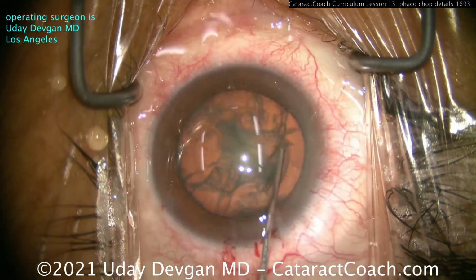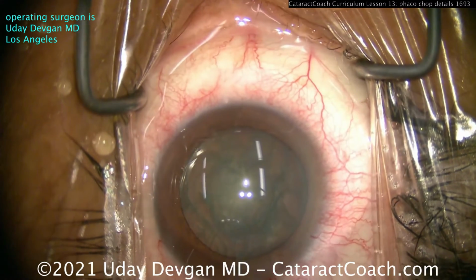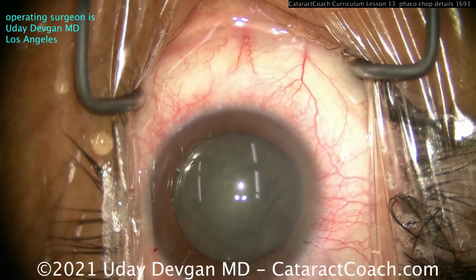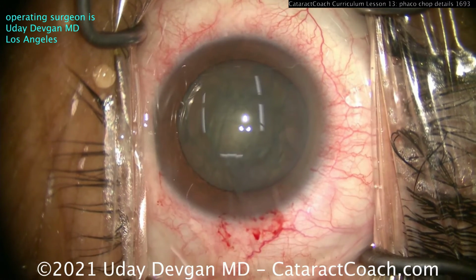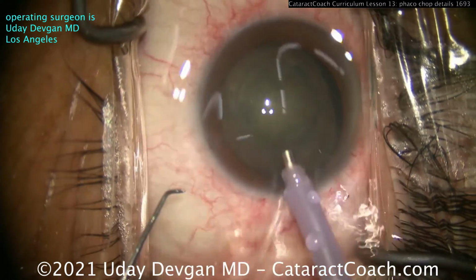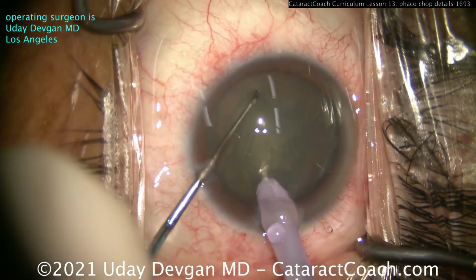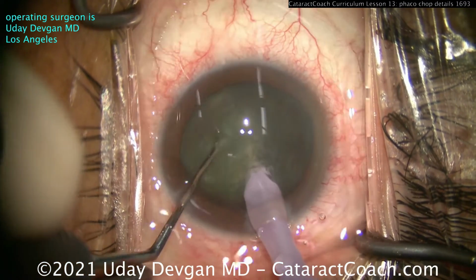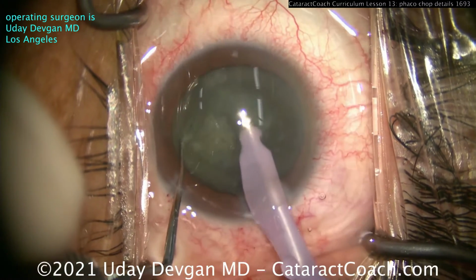We're going to leave it in the capsular bag to show you how to deal with a mushy nucleus that just won't chop. So here it is. There's the mushy nucleus. You can see it's just an indistinct kind of blobby, gooey stuff. Putting the Phaco probe in there. We're on chop mode. High vacuum, high flow. Let's try to chop it. And we go in and it's just mush. There's a little bit of a chop, kind of, but it's kind of mush.